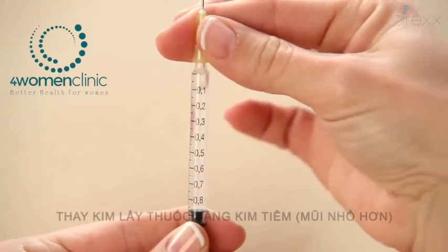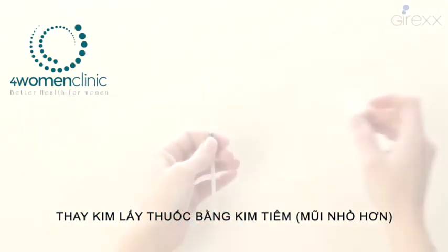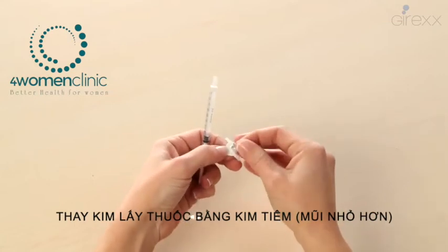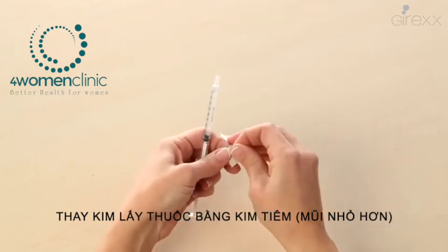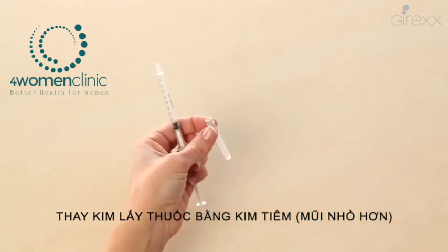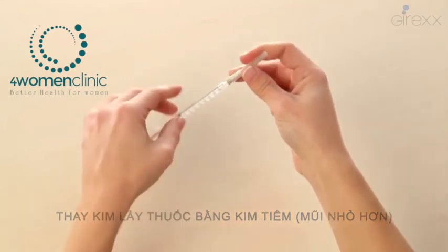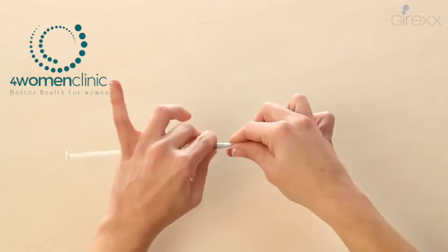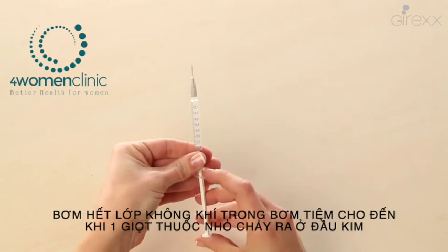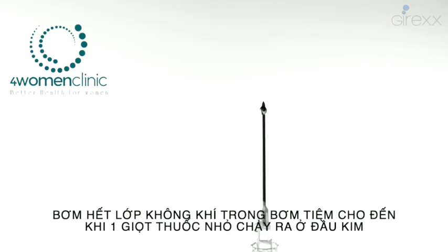Take out the needle and throw it away into a special container. Open the small needle, remove the cap, and put it in the syringe. Gently tap the syringe so the air bubbles come to the top, then press the plunger gently until a few drops come out.